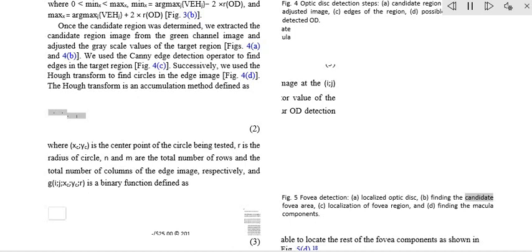The EROD upper and lower bounds are calculated using the following formulas. 11. 12. Where YC is the vertical centerline of the retinal image, ROD is the diameter of the OD, and LEROD and UEROD denote the lower and upper bounds of EROD, respectively. We called an image MSRI if it has both the OD and the fovea within EROD. Furthermore, we defined a new suitability metric, S, for retinal images, which is calculated using the following formula. 13. Where YOD is the Y component of the OD position. Hence, our metric decreases when the center of the OD approaches the image's centerline.